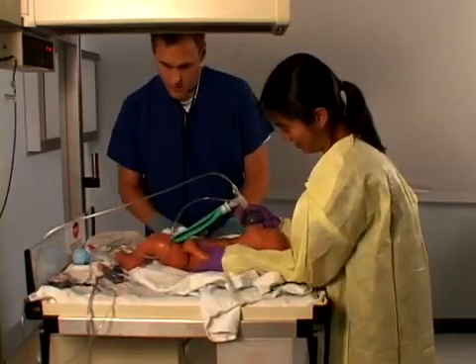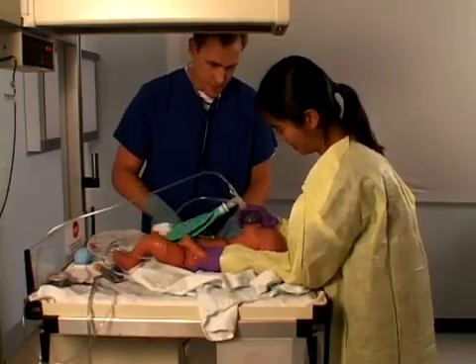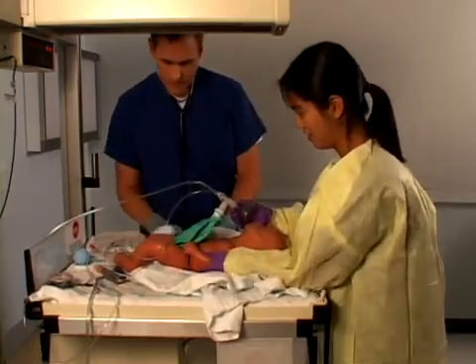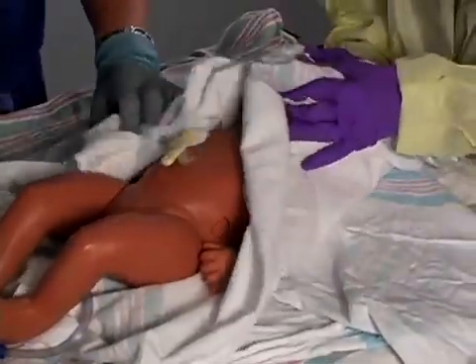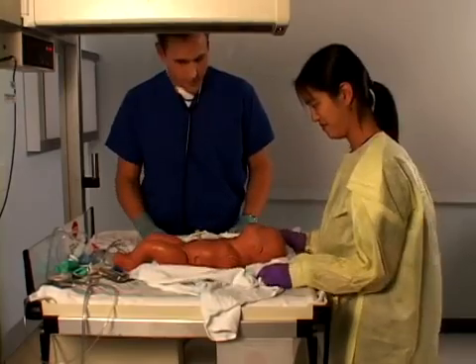This baby is still at risk for developing problems and requires observational care while with his mother. Should we see how he does without the oxygen? Right. Looks good. He's a cute one. Should we wrap him up and give him to Mom? Sounds good.